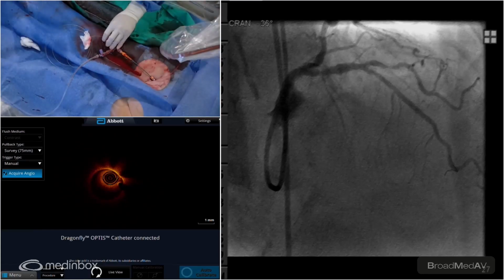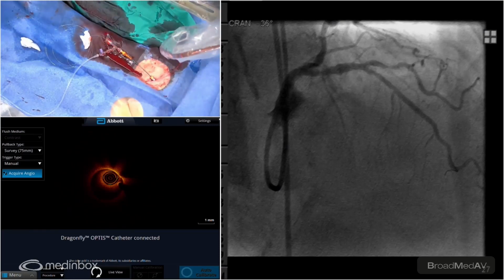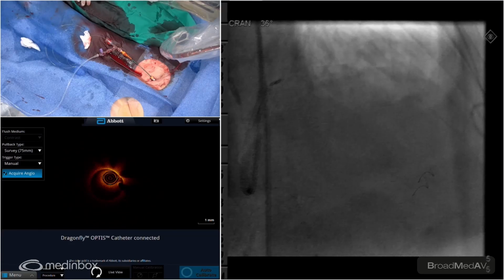Should we put another wire and then just do OCT? I think you can probably go through the OCT through this, can't you? I think so, but it's just much more cumbersome. You may switch over or just rewire with the second wire? I'll just get another wire or universal wire, put another wire. Yeah, let's do that. Take a picture, and we'll get an ACT as well. Yeah, we'll do this. Get the BMW ready for us, please.